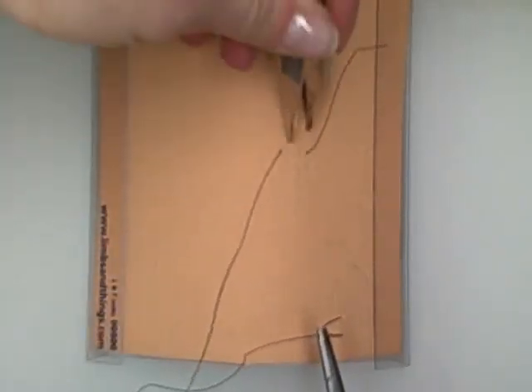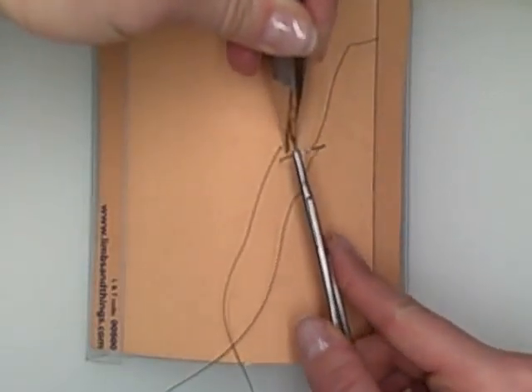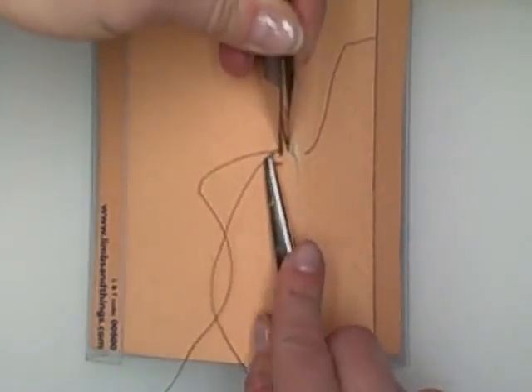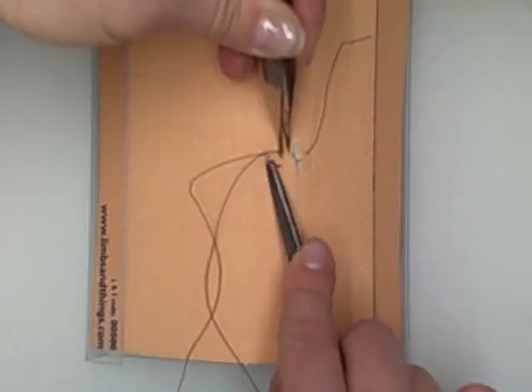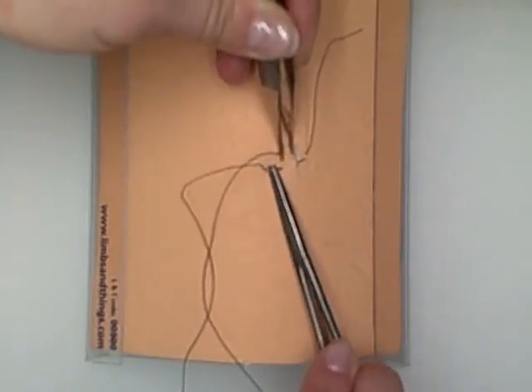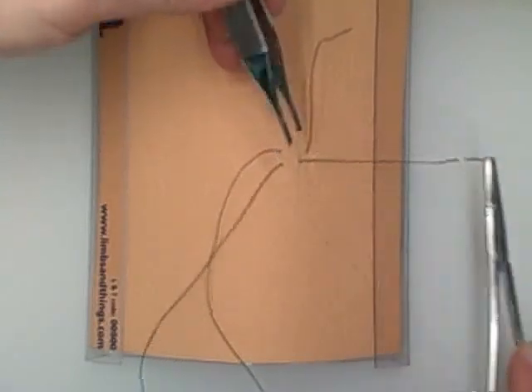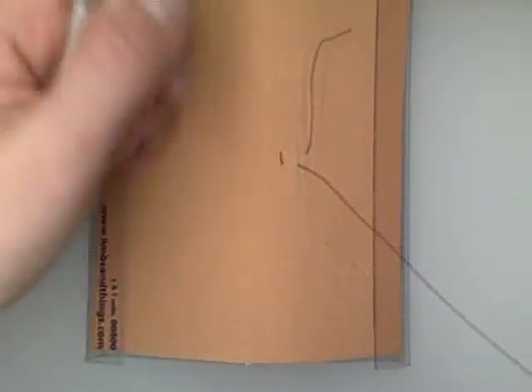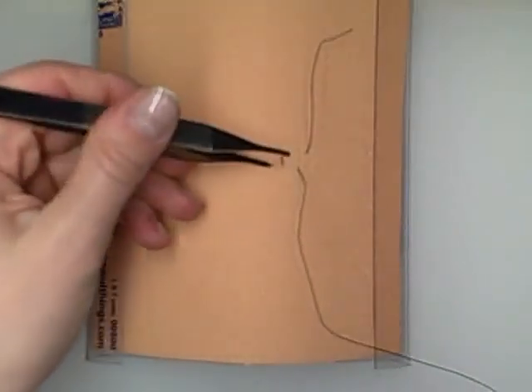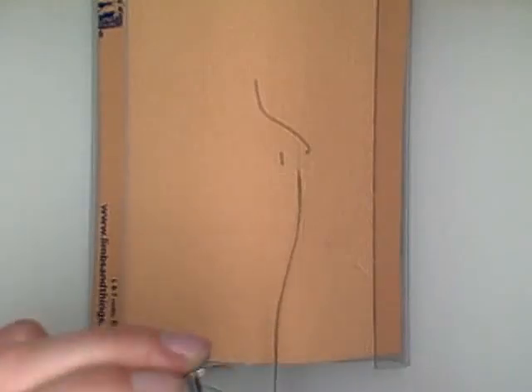And then we're actually going to come in just below this stitch right here. And actually pull the tail through a little bit there. Again, we're going to reload backwards.